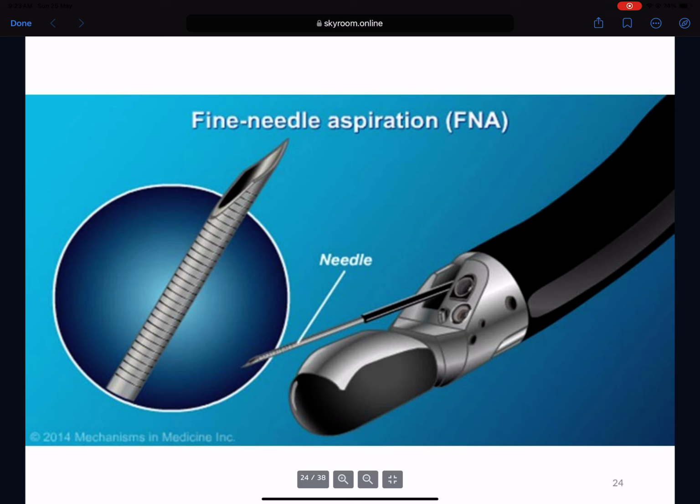And also, you have some other holes in this endoscope, like small holes for water to come out for washing the bleeding wound or something like that. Or you can even put some drug on some specific wound inside the stomach. So I mean it's a very professional method.